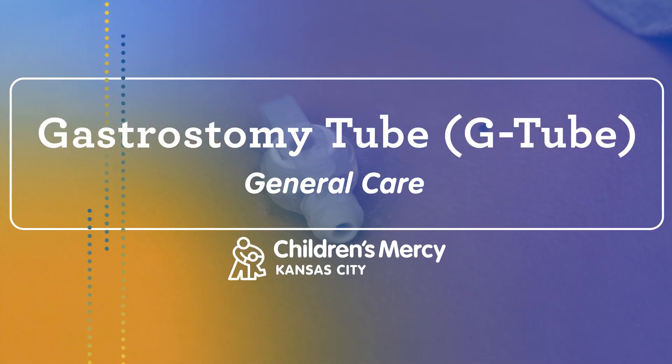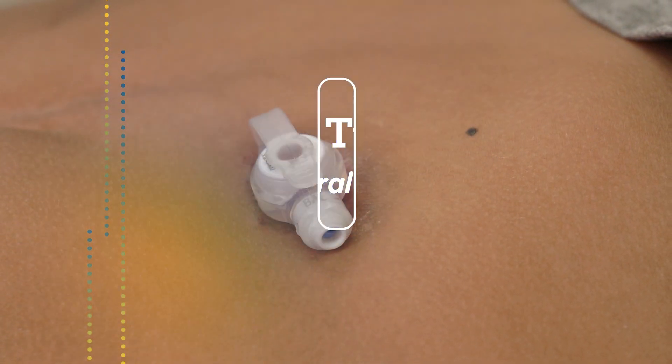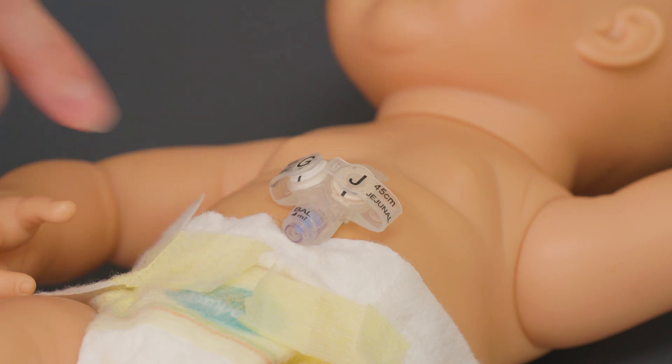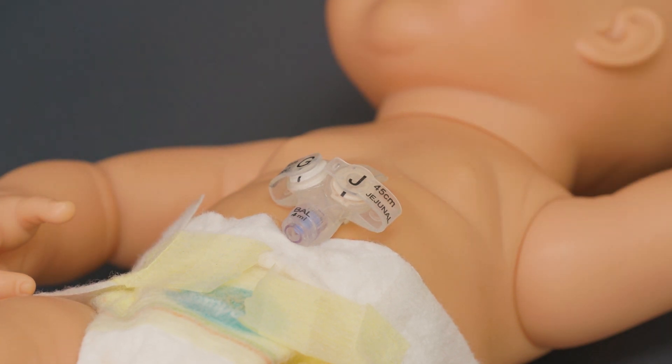After the initial sutures are removed, the gastrostomy tube should be turned twice a day during the first eight weeks. If your child has a gastrojejunostomy or a GJ tube, do not rotate their tube.